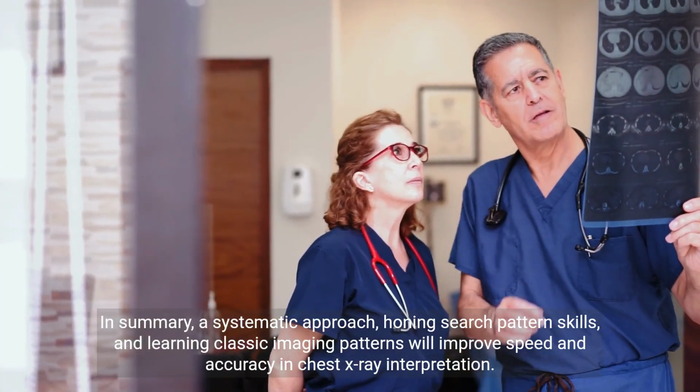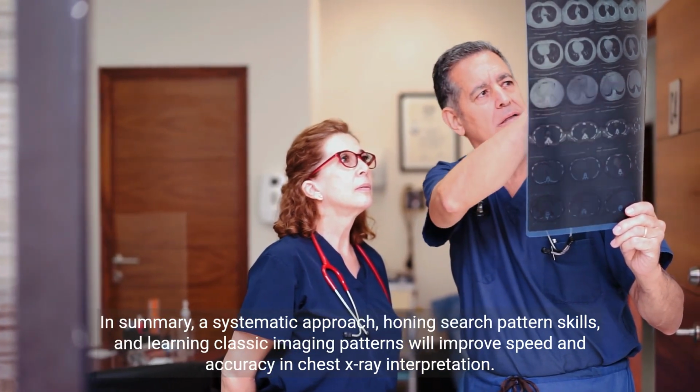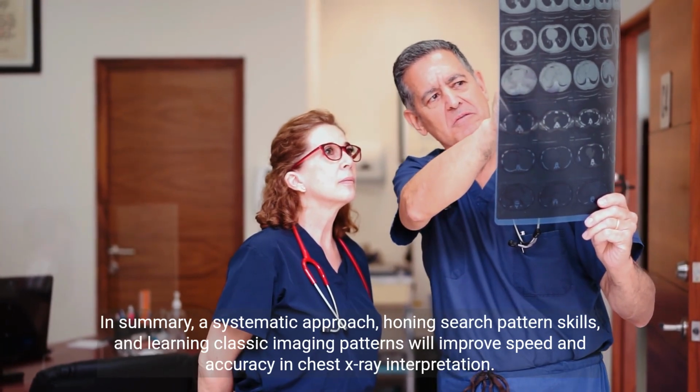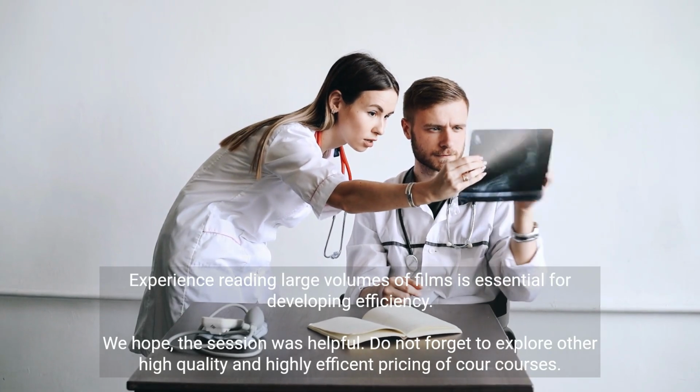In summary, a systematic approach, honing search pattern skills, and learning classic imaging patterns will improve speed and accuracy in chest X-ray interpretation. Experience reading large volumes of films is essential for developing efficiency.